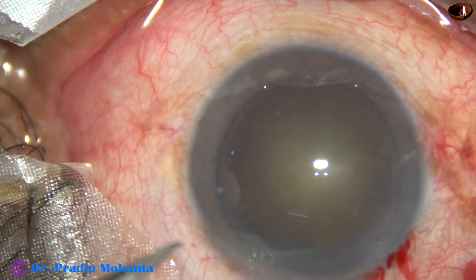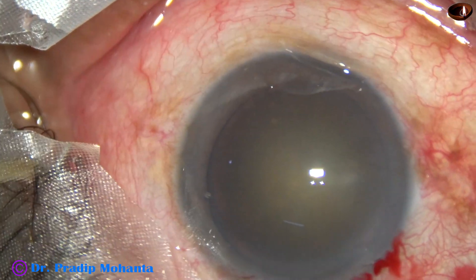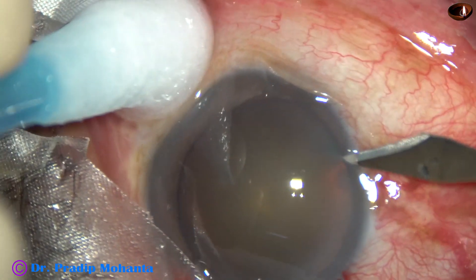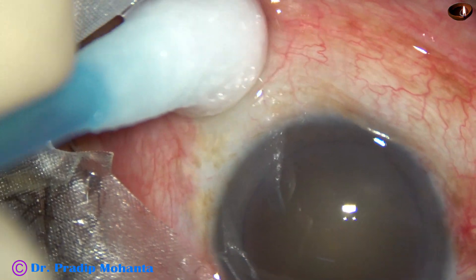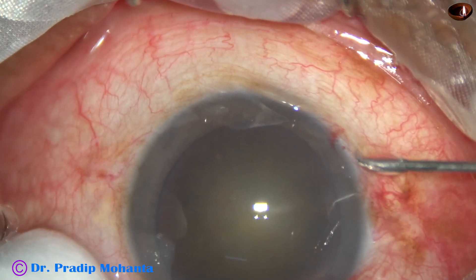Now, this is a side port on the left side of the main incision, about 2.5 clock hours away. And this is another small side port on the right side of the main incision, about 3 clock hours away.